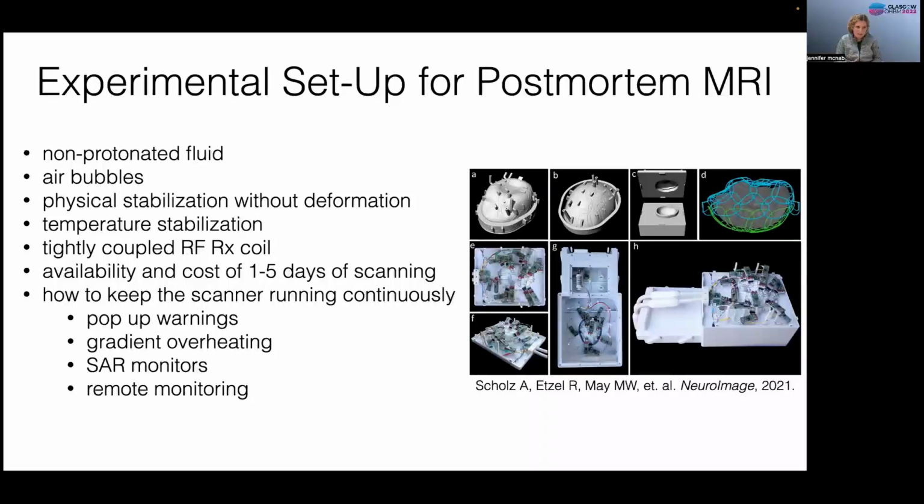And then there's also issues just in terms of keeping the scanner running continuously. These scanners aren't set up to do so, and there can be lots of pop-up warnings, and you run the risk of gradient overheating from running it continuously for so long. There's pesky SAR monitors, which aren't really relevant to the postmortem tissue, but can be difficult to turn off. And remote monitoring can be really, really helpful to run these types of experiments.